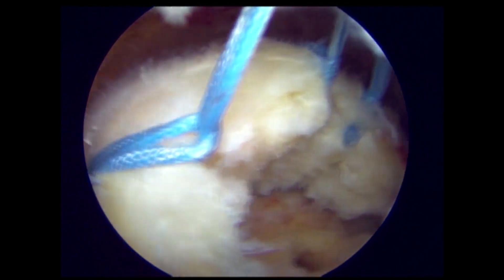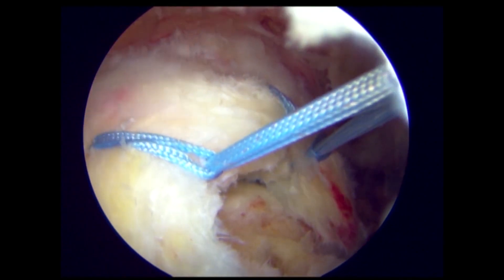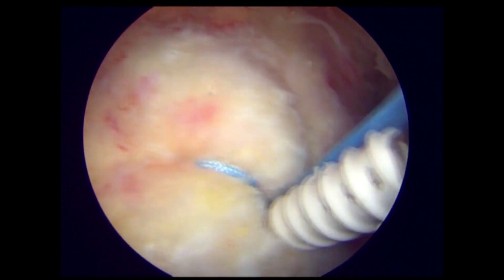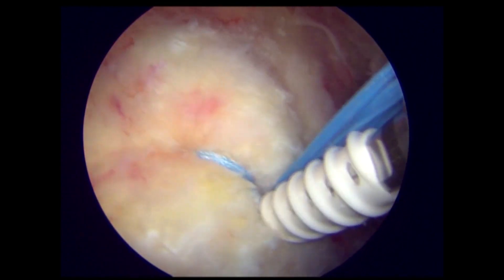This is a tear with a large radial distance. Three mini tape sutures have been placed in a luggage tag fashion in order to create a purse string type repair. The mini tape provides evenly distributed compression using a low profile suture, while the helicoil knotless anchor's internal locking mechanism provides excellent fixation independent of bone quality.